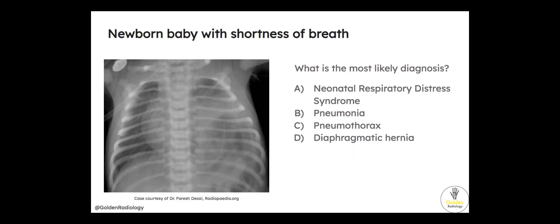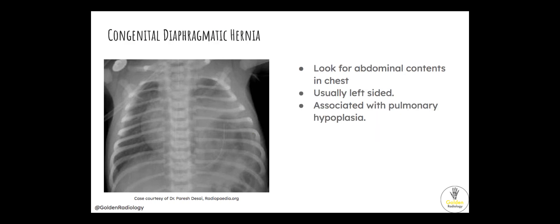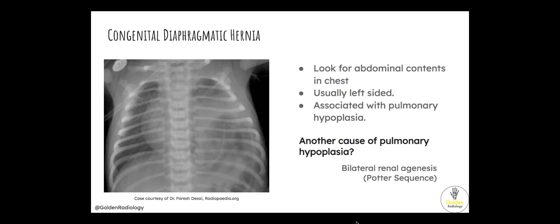Next question. Newborn baby with shortness of breath — what is the most likely diagnosis? Neonatal respiratory distress syndrome, pneumonia, pneumothorax, or diaphragmatic hernia? This is congenital diaphragmatic hernia. If you look closely, you'll see the oral gastric tube going up into the left hemithorax — the stomach, which should be below the diaphragm, has ended up there. These hernias are typically left-sided because the liver on the right has a protective effect. Congenital diaphragmatic hernias are associated with pulmonary hypoplasia, because the herniated bowel contents squish the adjacent lung and it doesn't form properly. Another cause of pulmonary hypoplasia to know is bilateral renal agenesis, or Potter sequence.